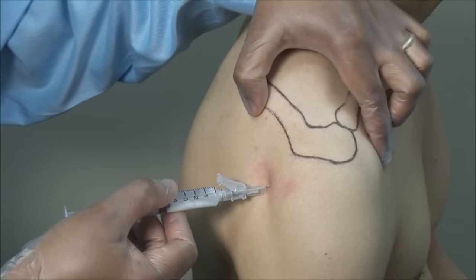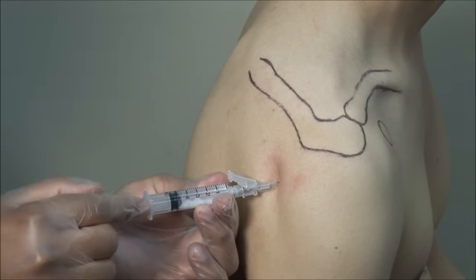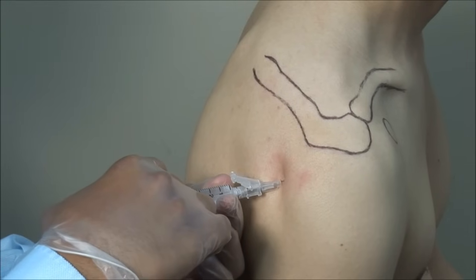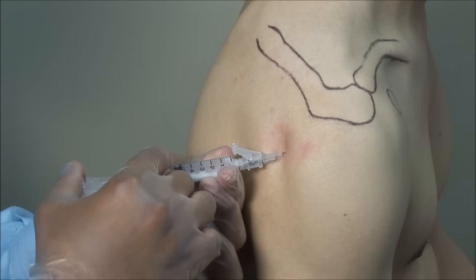Always aspirate to ensure you are not in a blood vessel. Then inject the solution — this should go in smoothly. If there is any resistance, withdraw and adjust the needle to avoid tissue injury.